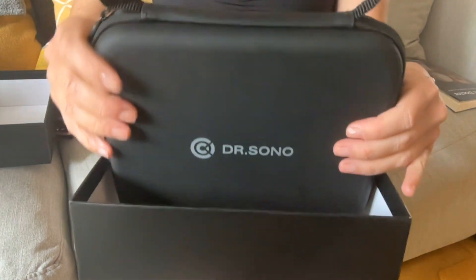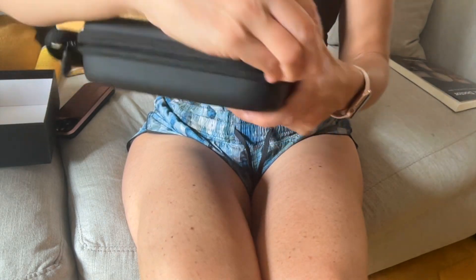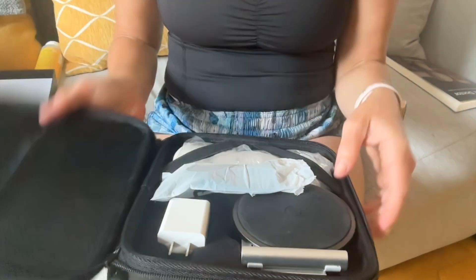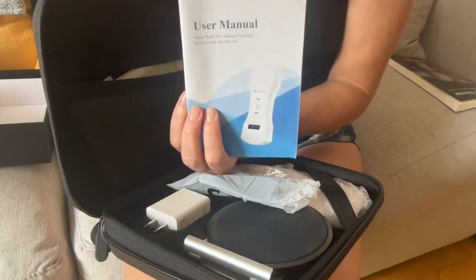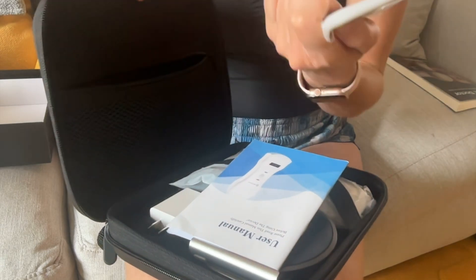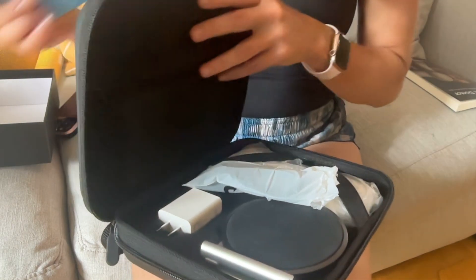It comes in this nice carrying case. First, we have a guide, a user manual on the inside of this pocket, as well as your warranty card. I'm going to take the user manual because we're going to use that.